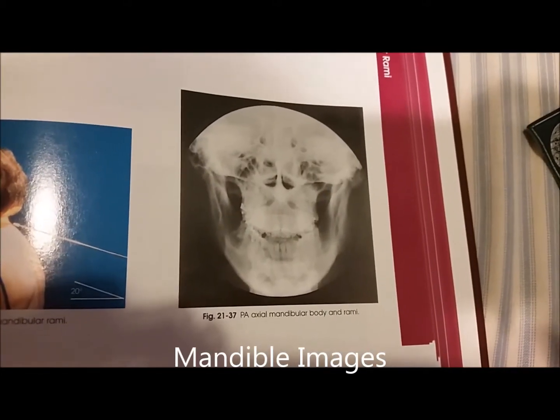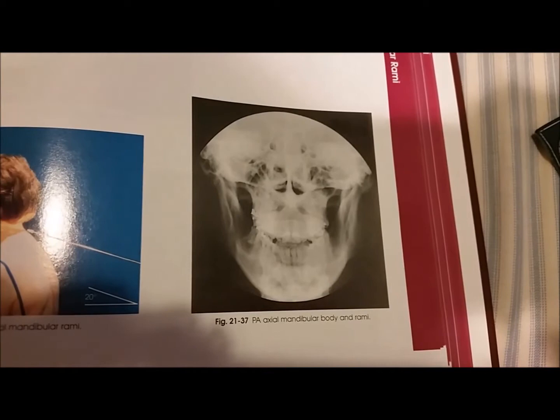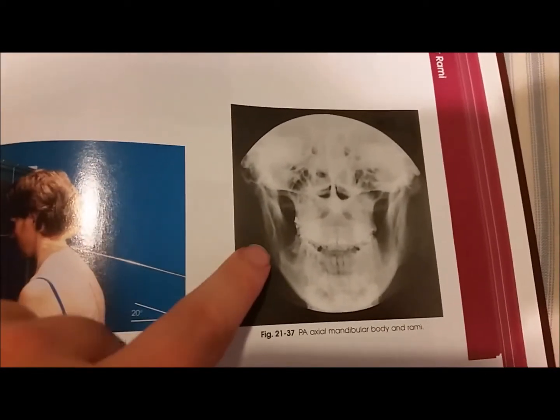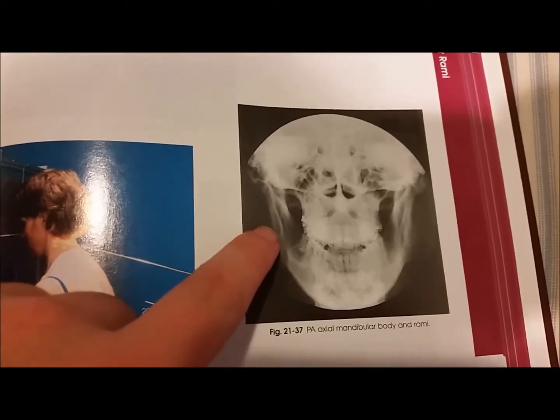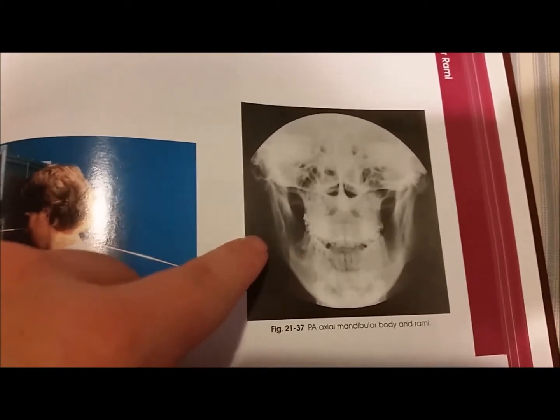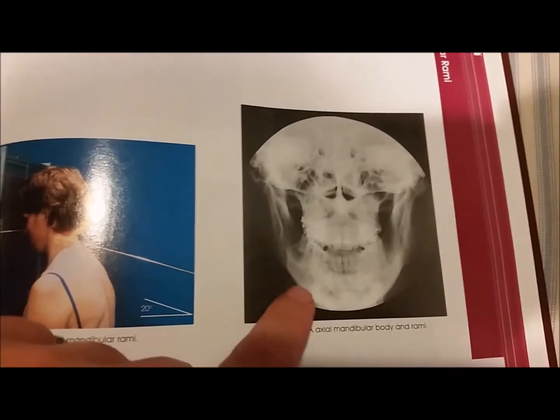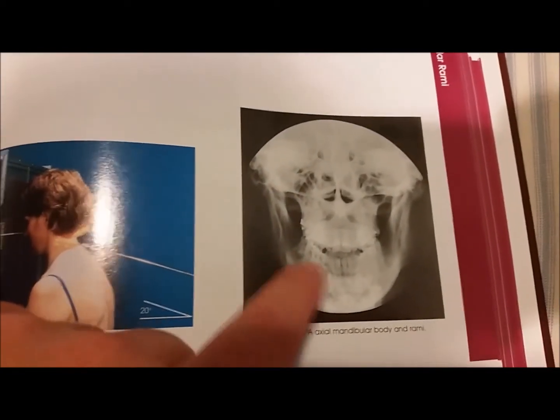All right, now I'll take a look at the images that we did for the mandible, beginning with the PA axial projection of the rami. You can see right here that the rami are nice and elongated, which makes it easier to visualize any sort of displacement or fractures right there. You can also make out the body a bit, but there is some loss to superimposition right there.